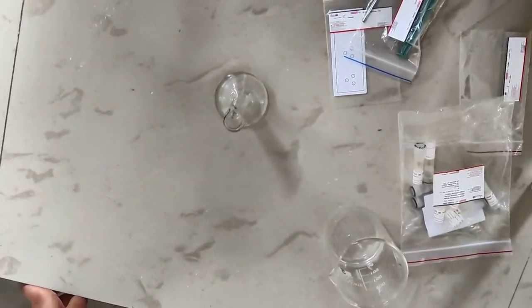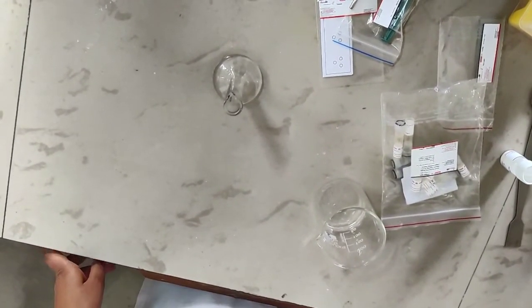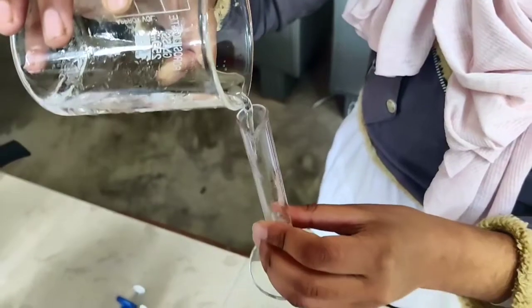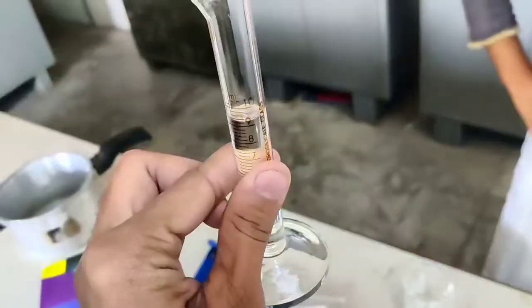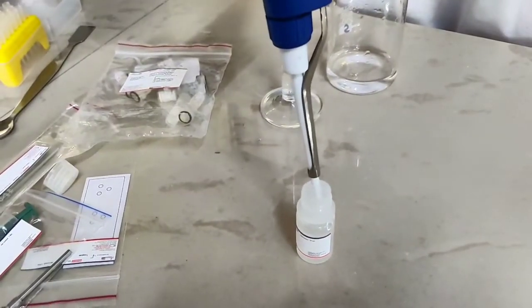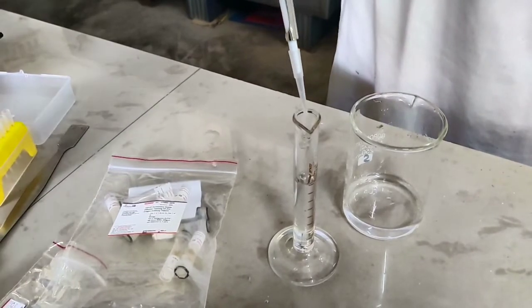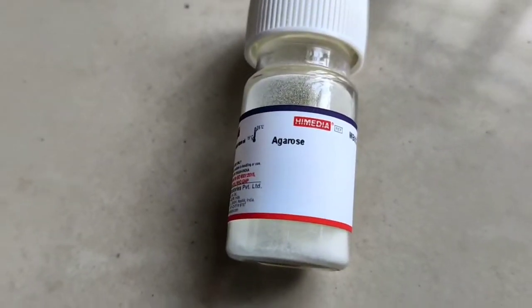Now we will prepare 1x assay buffer. For that we need 10 ml of 1x assay buffer: add 1 ml of 10x assay buffer to 9 ml of sterile distilled water using a micropipette. Now we have prepared 10 ml of 1x assay buffer.